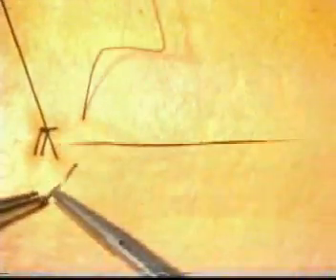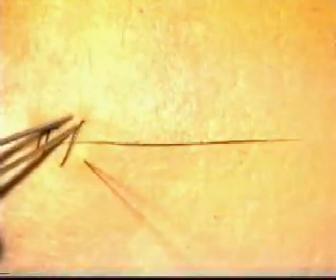Here comes the third suture, the distance apart being exactly the same as for interrupted sutures.